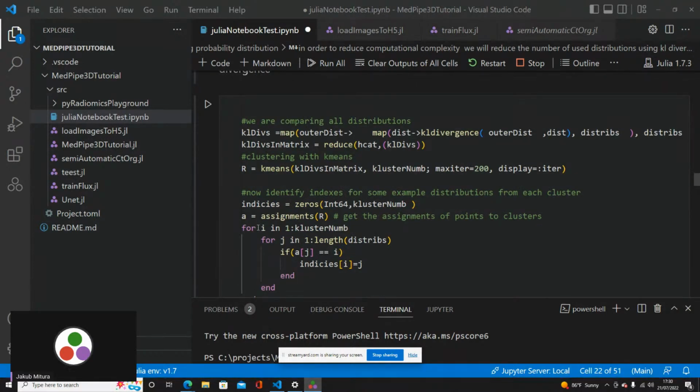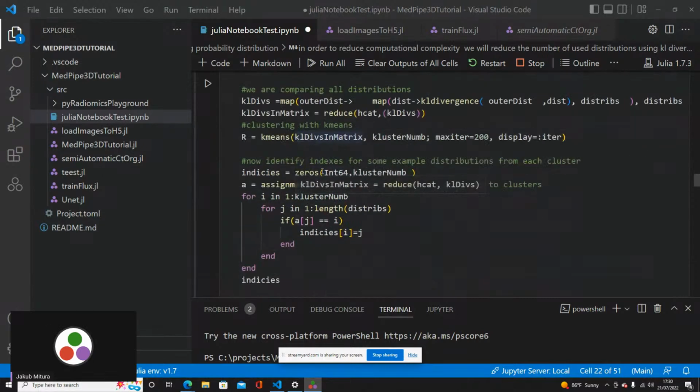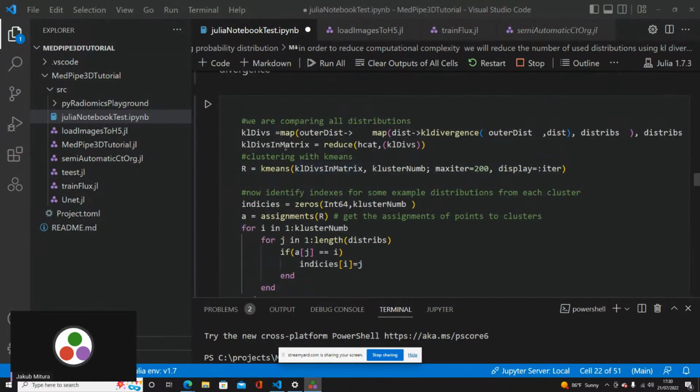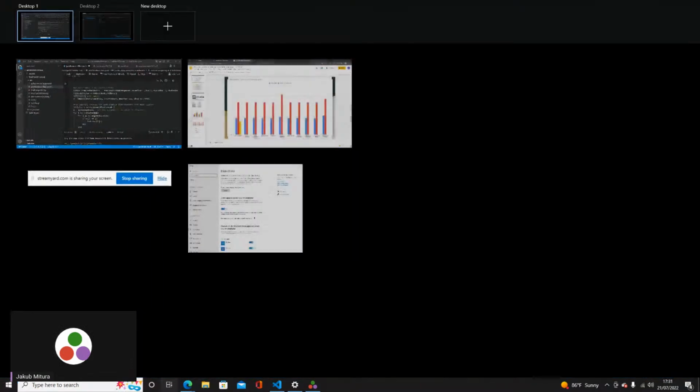We want to reduce it. How can we reduce it? This is just some idea that I have. It also shows that you can use any package, any idea that you have, and play with it. I created some simple clustering.